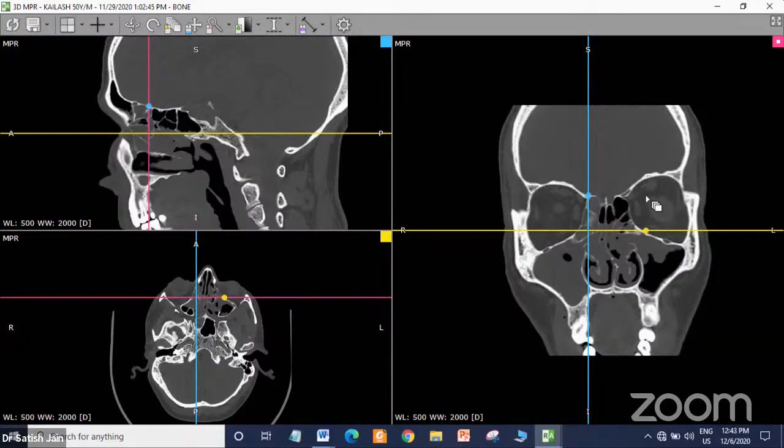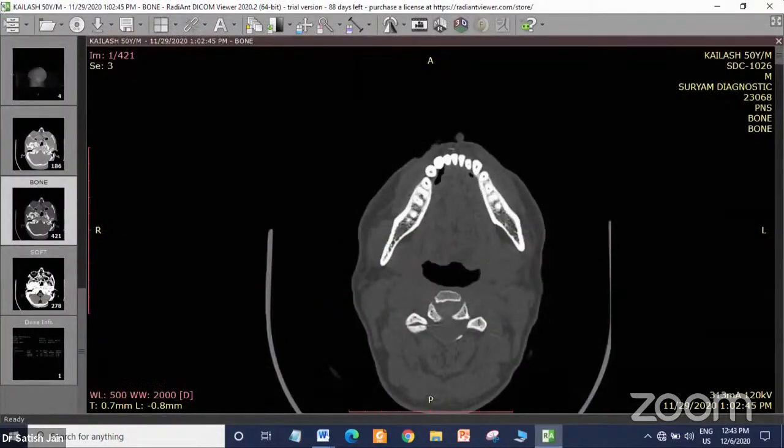for the surgery. And for that, the kind of CT scan required, what you see on the screen here, is 0.5 mm on DVD. 0.5 mm so that you can reconstruct in all planes with full details you have on DVD. So like this particular scan, this is 0.7 mm. See this.